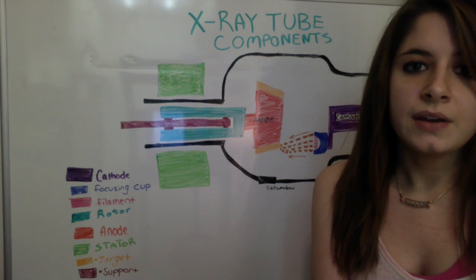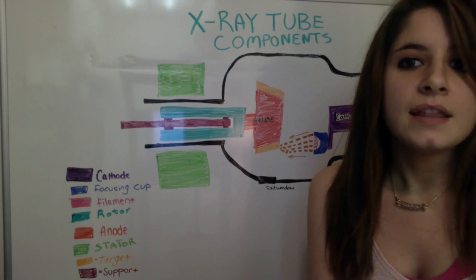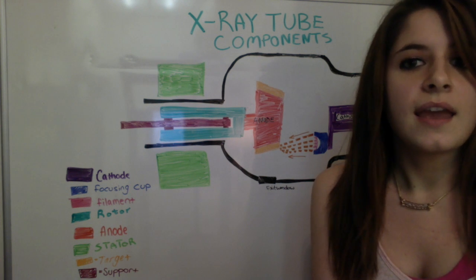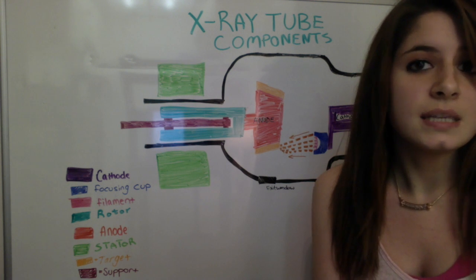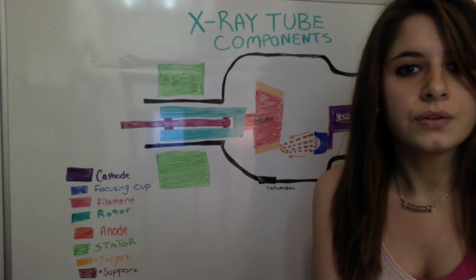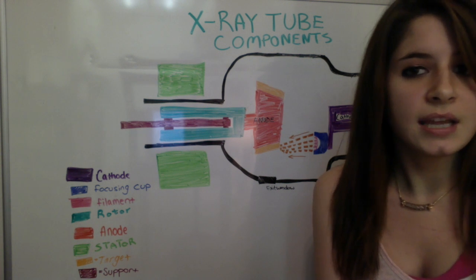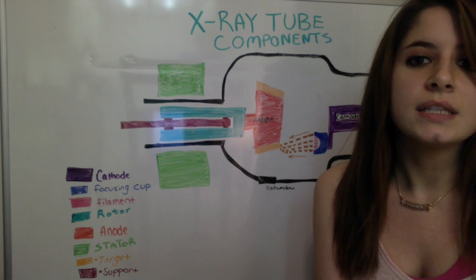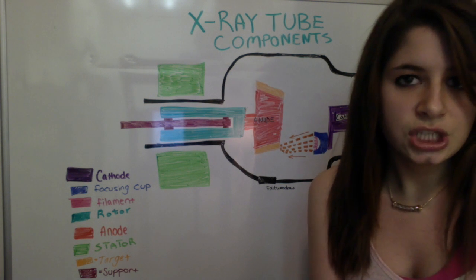Most X-ray tube anodes are a tungsten alloy, which has an atomic number of 74, and this improves the long-term radiation output of tubes. Tungsten is unique in its ability to maintain its strength at high temperatures, and it has a high melting point and a relatively low rate of evaporation. With X-ray tubes with pure tungsten anodes, the radiation output is reduced with usage because of the thermal damage to the surface. There are two types of anodes, stationary and rotating.